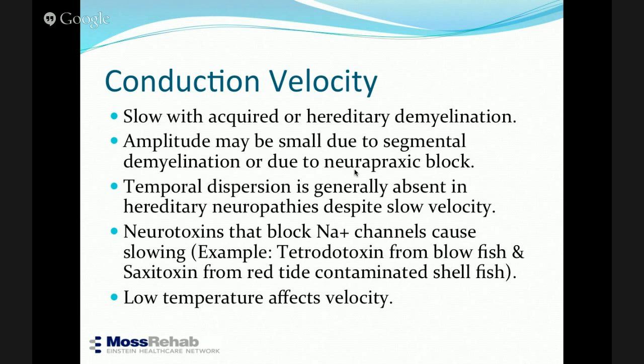And that's what happened probably with them. And then you can look at the conduction velocities and go from there. Temperature affects velocity, so be aware of that. Right? If you're low temperature, the conduction velocity is going to be slow. And that's one of the commonest mistakes made by the majority of electrodiagnosticians, thinking that the conduction velocity slowing is related to a pathological process, but really it may be related to low temperature, and they have never recorded the temperature.